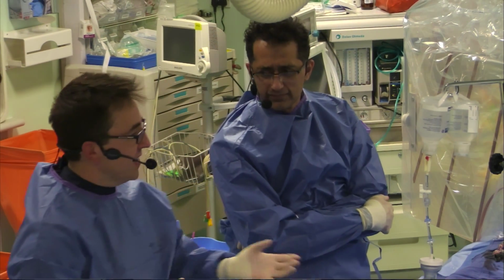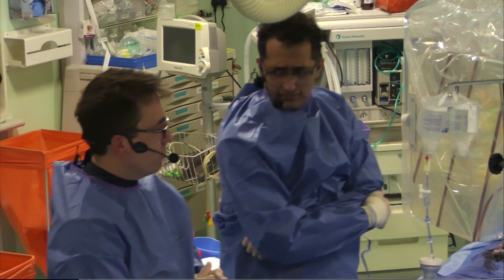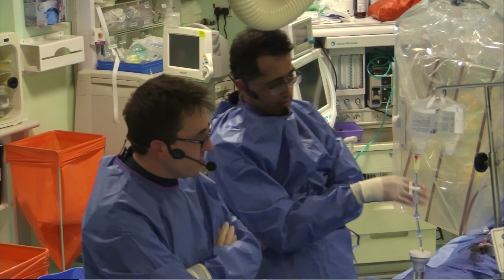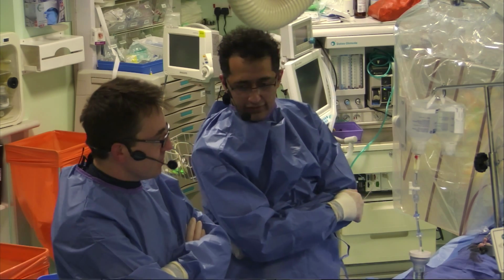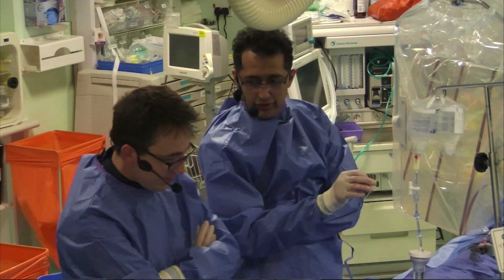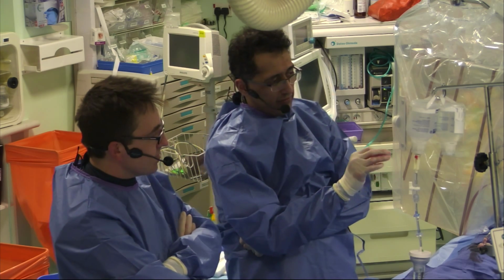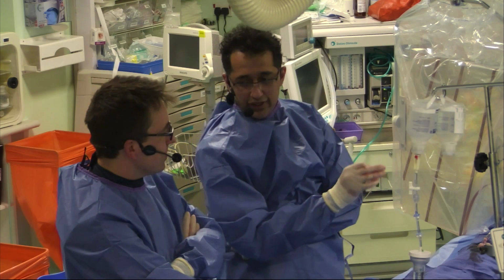So in this case here today, what do you plan to do with this artery? Are you going to leave it alone? So I think I'm tempted to not treat the middle of that vessel. Now, there was a question mark, if you recall at the start, about the ostium of the LAD. Now, clearly, functional significance of that ostium is highly unlikely.